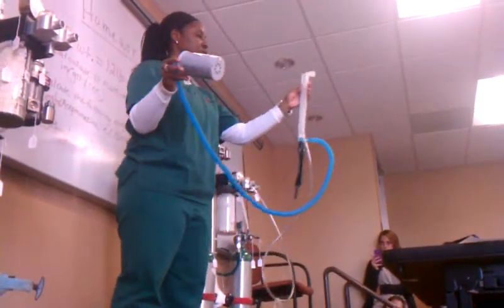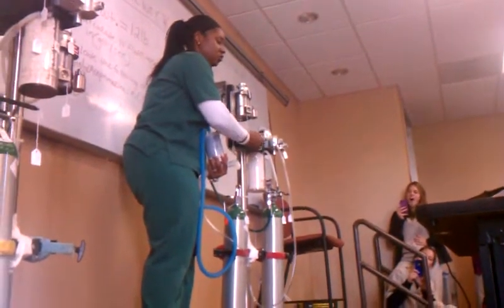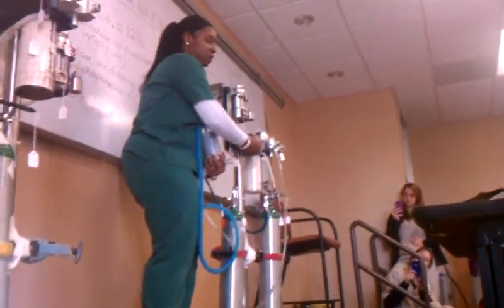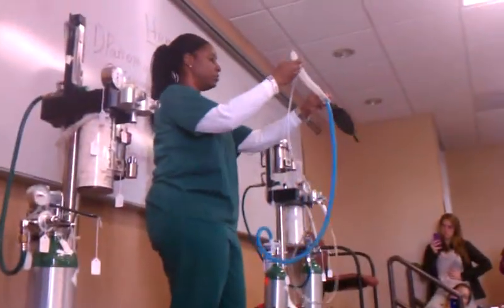The only difference between this machine and that machine is where the fresh gas outlet is. You need to make sure that you know where to hook up the clear tube — in the front on this machine, on the side on that machine. But again, this is our non-rebreathing system.